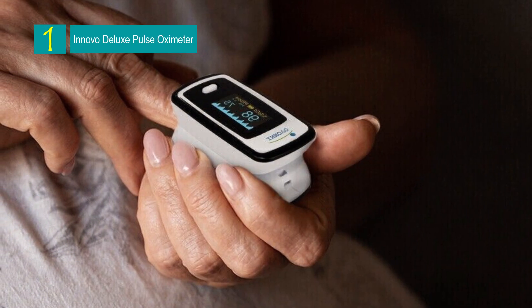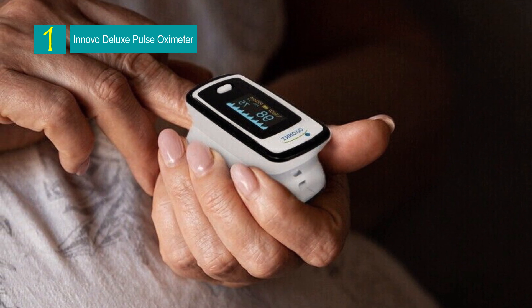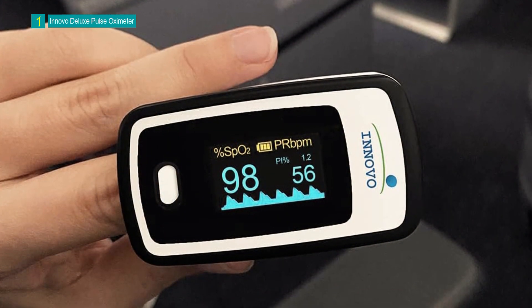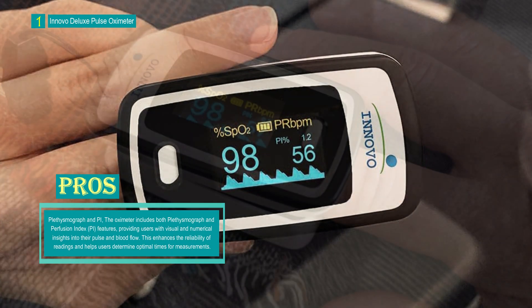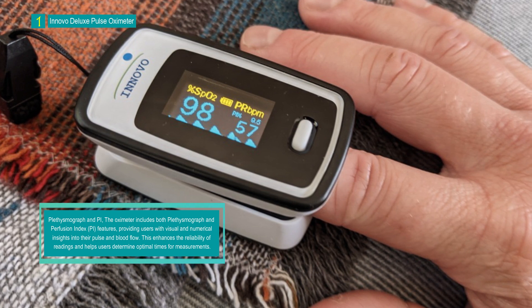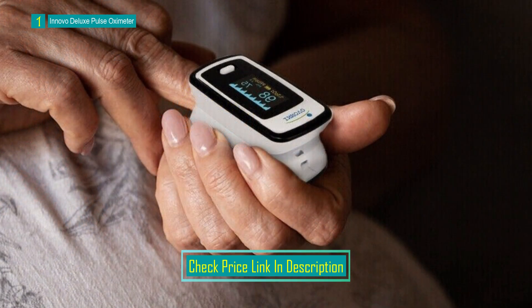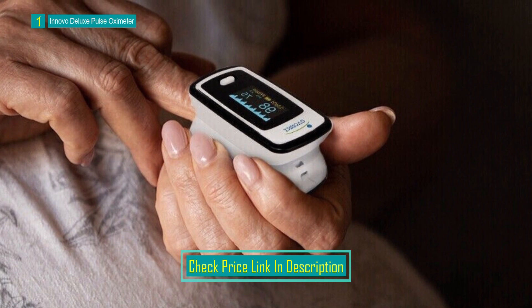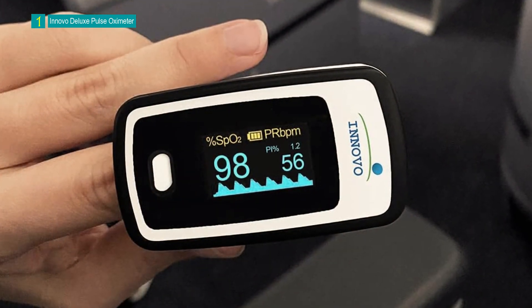Number 1: the Innovo Deluxe IP900AP Fingertip Pulse Oximeter. This technologically advanced device is designed to measure and display SpO2 blood oxygen saturation and pulse rate. With features like plethysmograph and perfusion index, this oximeter aims to provide accurate and reliable readings, eliminating second-guessing and improving user confidence. The device is equipped with a high-quality OLED screen offering six multi-directional display choices. It is powered by two AAA batteries with a battery life of up to 40 hours, and weighs 42.5 grams.